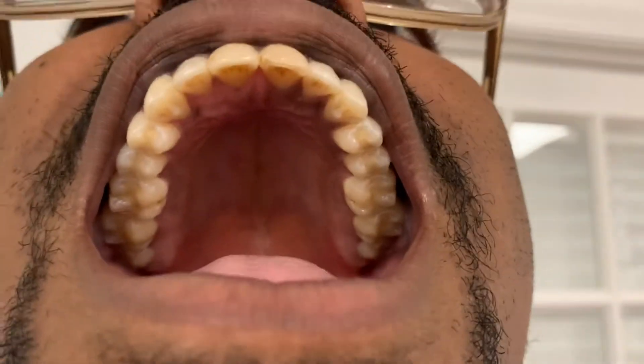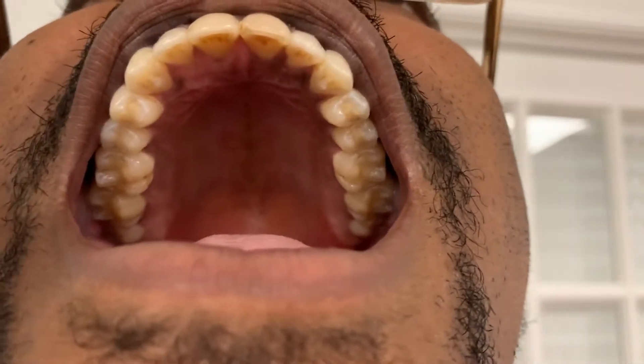This one can be a little bit tricky. You want to bring your phone as close up to your mouth as you can — that is perfect right there. You can see the whole arch if you look, and that's for the top.